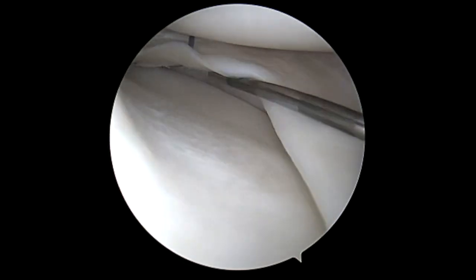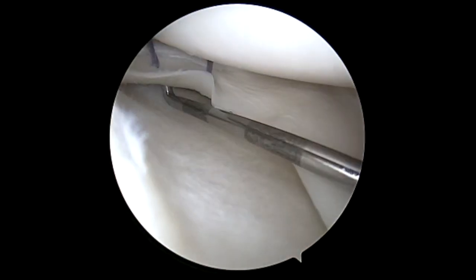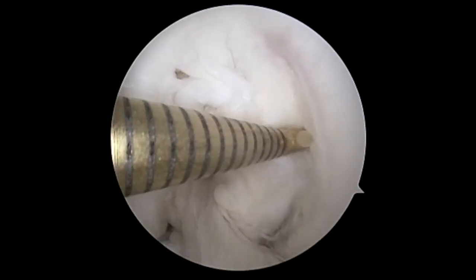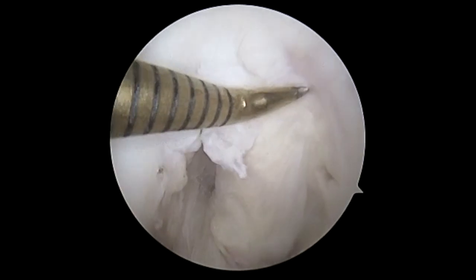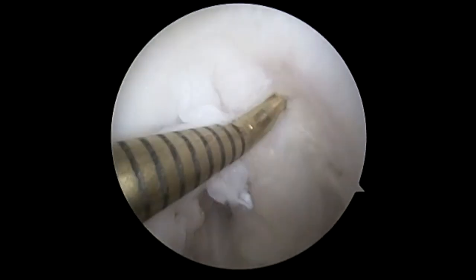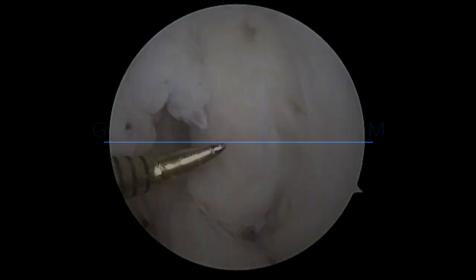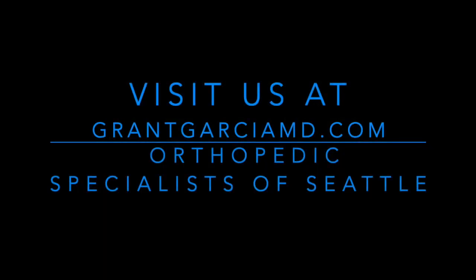We're going to probe. There's no further propagation of the tear, and you can see here that the tear is adequately tensioned. We're going to use a microfracture. The nice things about this device: lower tissue penetration and damage, and decreased chance of pullout — the back sutures are the same, but you now have a smaller hole.